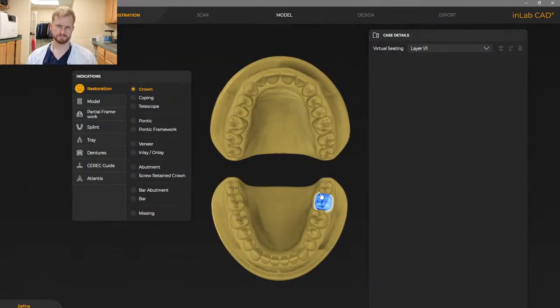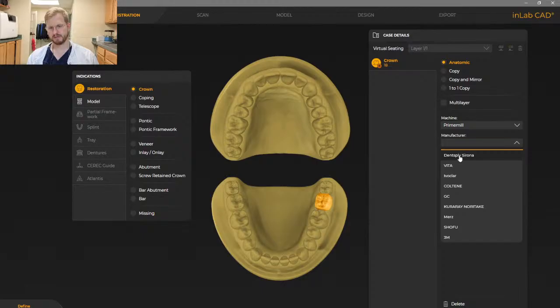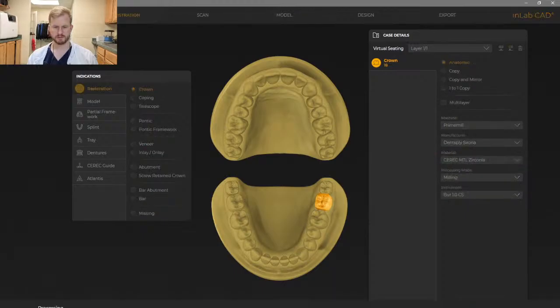Welcome back. We're live with tooth number 18 today. So patient presents with a fractured distal lingual cusp. I will show you what that looks like in just a moment after we designate our admin phase for a zirconia crown.